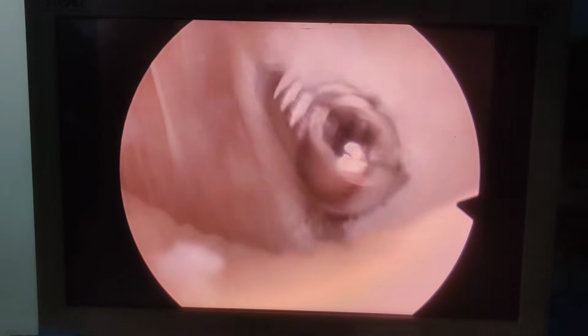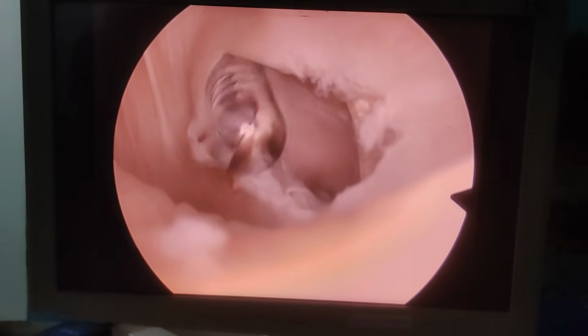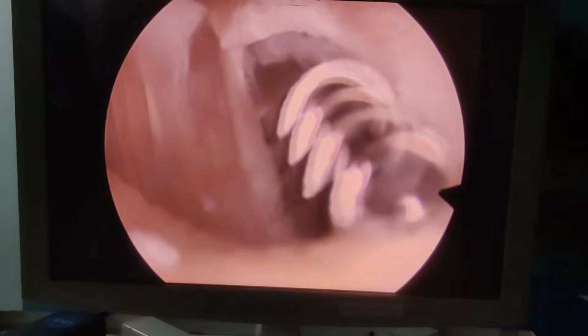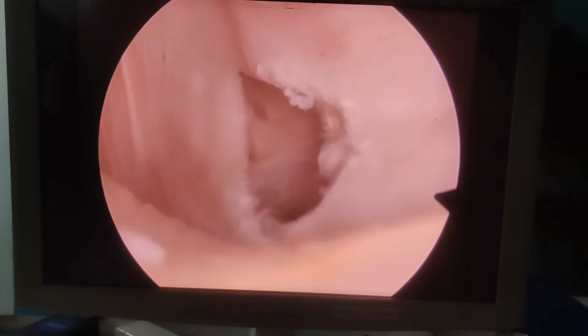So once I have put my knife and my needle, I use a shaver just to create a space, because you don't want to be struggling when you are coming in and out. So shaver is a good safe tool. So I'm just going to widen my posterior medial portal, and then we'll pass something like a messenger rod, and I'll show you, and then we'll pass a cannula on top so that we can start working on our back. So I think that's done.